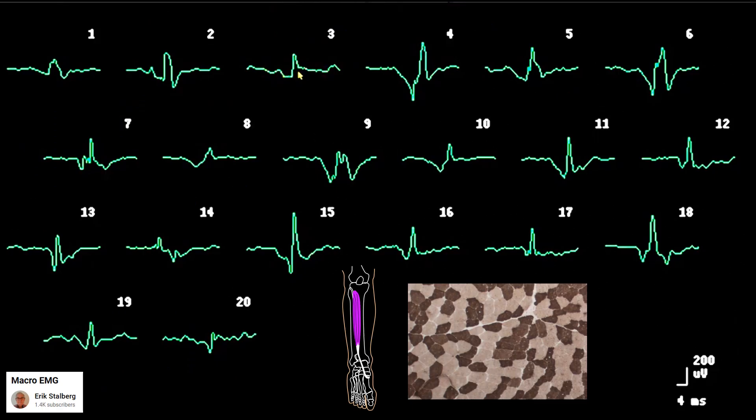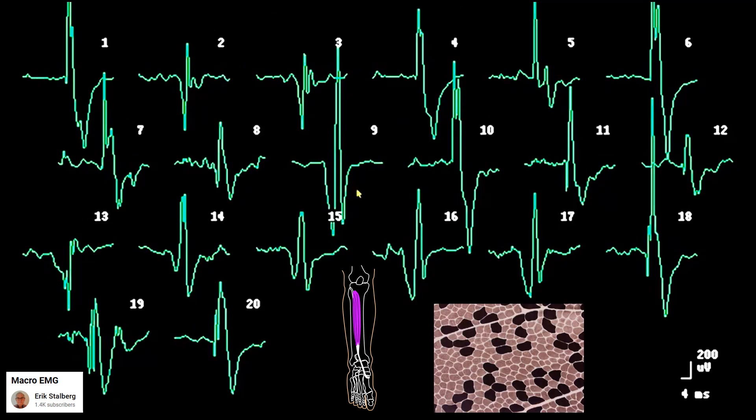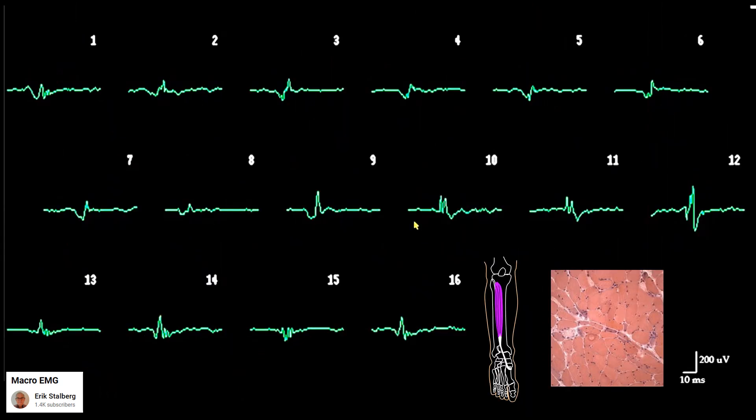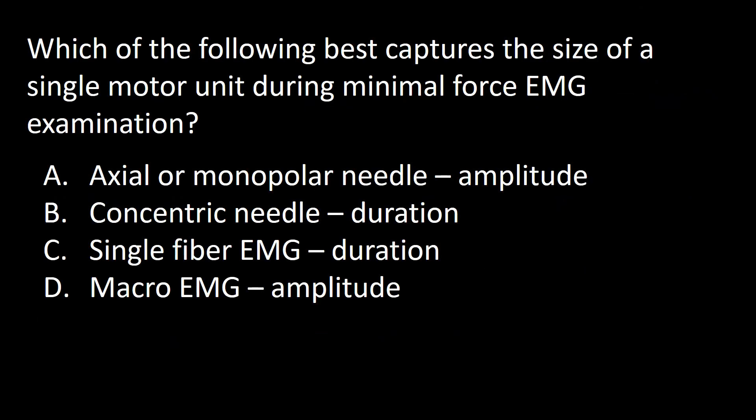This is an example of macromotor units collected from anterior tibialis normal muscle. This is an example of large macromotor units collected from anterior tibialis that has undergone reinnervation. Notice the grouping and predominance of type 1 fibers. This is an example of small macromotor units typically found in myositis collected from the anterior tibialis muscle.